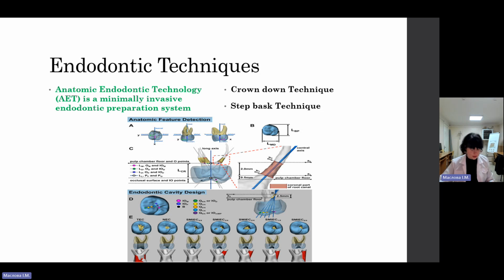An important result of morphometric studies of the root canals of human teeth is that apically the canals may be wider than assumed and should be enlarged more than has commonly been done. In some groups of teeth, like the incisors, considerably more. The apical box preparation technique was developed with this information in mind.